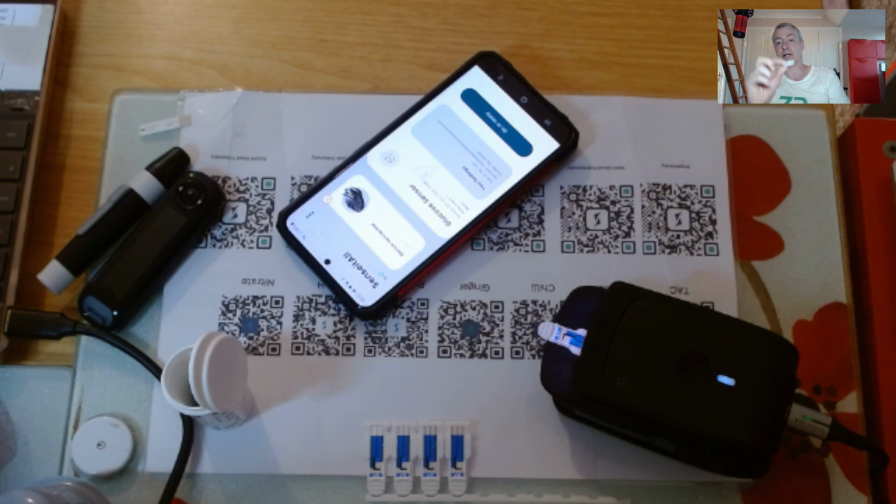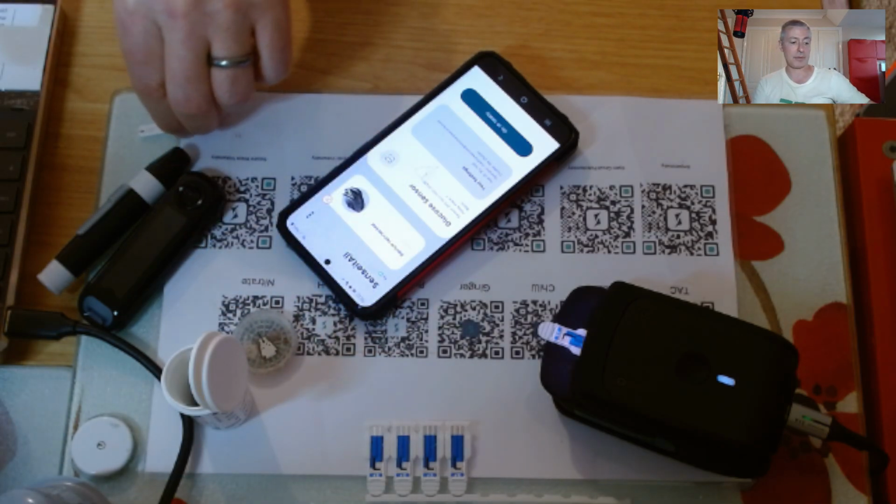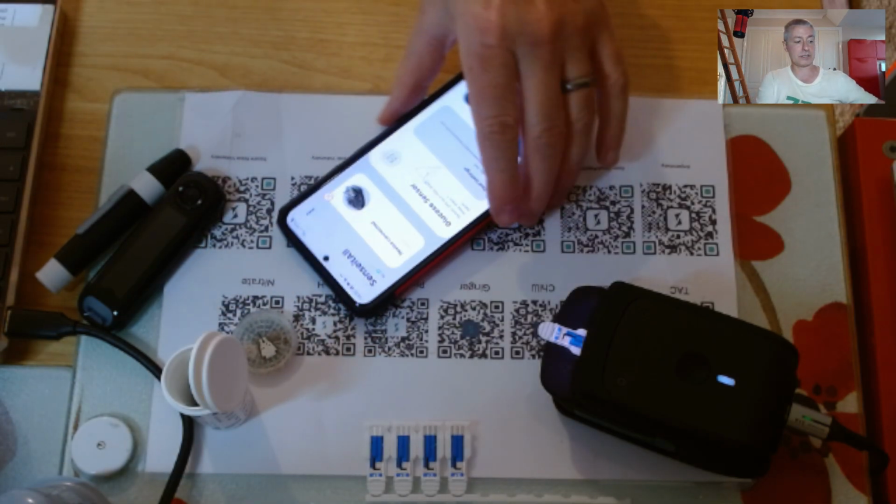And it's worth saying that in order for Dexcom to get onto the market with their first generation product, I think they spent something like $500 million US, and they were still requiring calibration. So the quick answer to your question is, yes, I think it will require calibration. How will that happen? Well, this is how it happened for everyone else's technology.